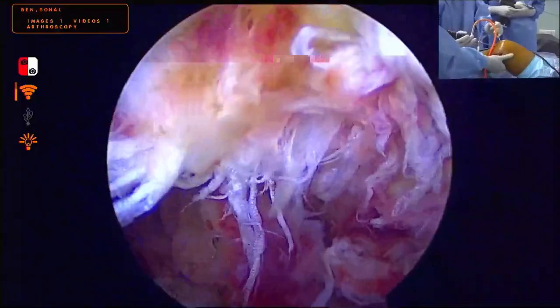Tunic please. Tunic time. So this is good enough. Take it. Cannula please. Seesaw. So this is good enough. Okay. So good. Extend please a little bit more.